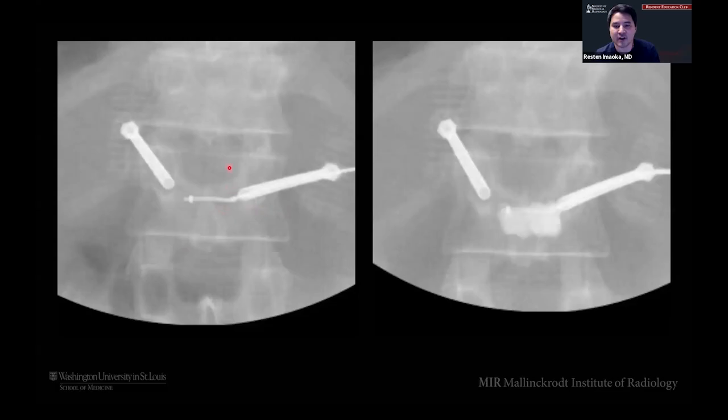So this is your balloon. You're going to center that in the middle, right? Again, we're using a true AP here. So we've got a spinous process in the middle, right between our pedicles here, and you're making a cavity, right? And the goal for kyphoplasties is a cavity creation or a cement filling from pedicle to pedicle and superior to inferior end plate, right? Depending on the fractures, if there is a fracture or not, you may not get up here, right? If it's healing on its own, sometimes it's so sclerotic, it just forces the balloon one way or the other, but that would be the ideal goal.